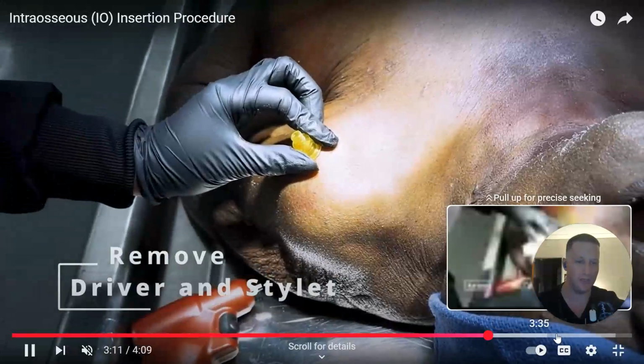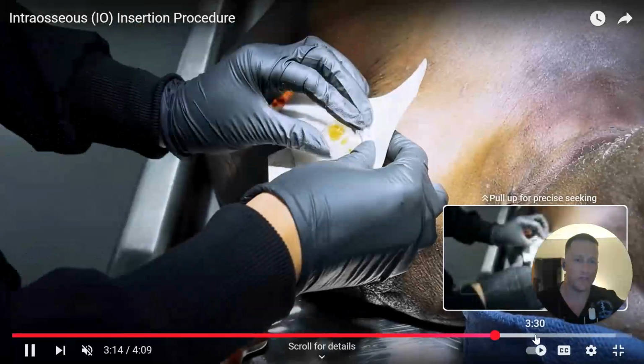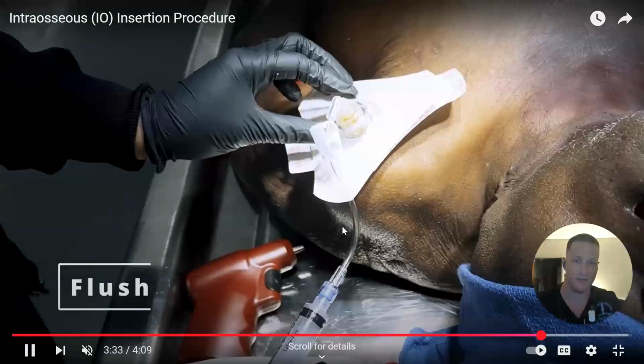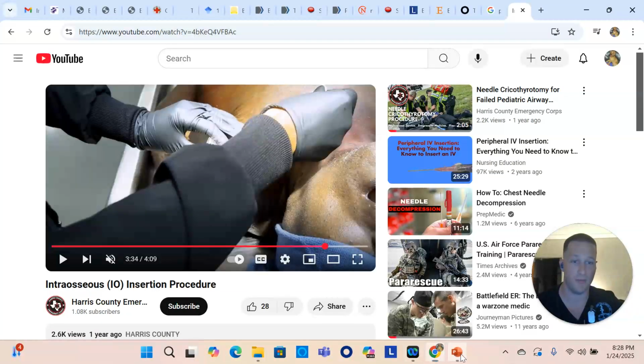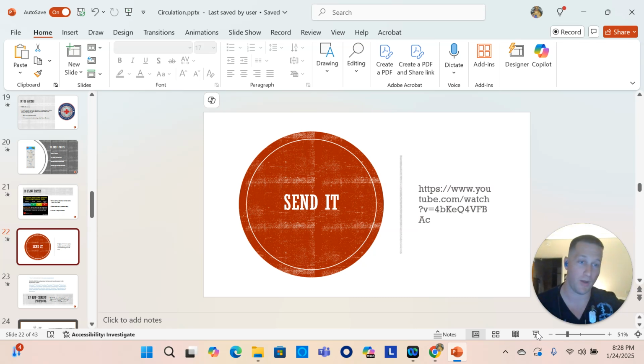And then what they'll tell you is to put this tubing on there. You should be able to aspirate marrow out of that. When you pull back on that tubing, marrow should come out. The manufacturer will say you don't have to have marrow, but getting marrow back in the tubing has a much higher success rate of having the IO in the place that it needs to go. Okay, so aspirate back on that tubing, and you should get marrow in there. If you don't get marrow in there, really gotta watch that line and make sure that it's actually in there, because you might have some doubts about whether it's actually where it should be.